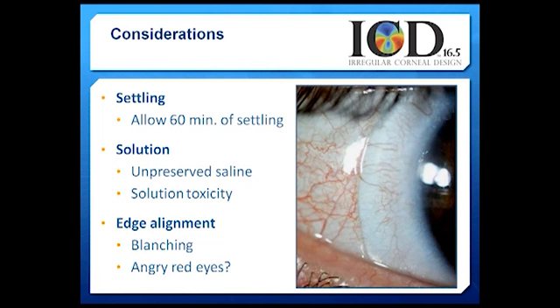The reason for this is not clearly understood at this point. However, we do know that a certain percentage of patients seem to get a more mucus-like appearance of the fluid between lens and cornea, and that lens needs to be removed when that fluid becomes milky so the patient can achieve clear, crisp, sharp vision again.